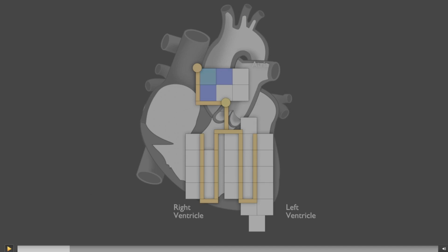Something else I can measure is the direction those depolarizations are going. So in our atrium, the impulses are moving down into the patient's left, right on the screen, but down into the left. When we get down to the ventricles, most of the energy is going down initially, and then we have a little bit of lateral movement, and then it starts to wrap upwards along the outside.